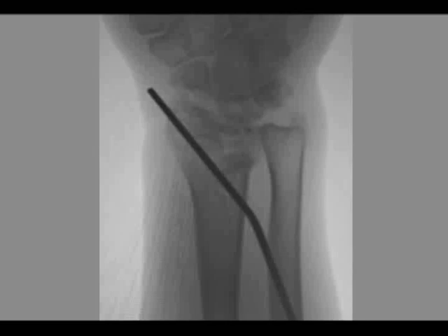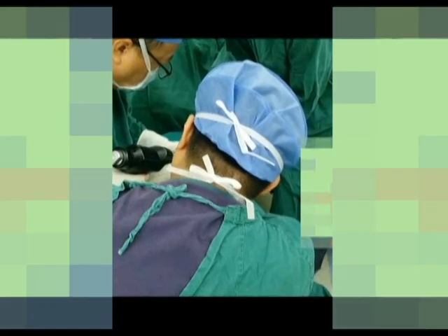The insertion point is often located at the radial side of the radial artery at the level of the proximal fragment. The radial artery can be palpated easily. Then we apply a force on the proximal fragment of the radius radially through the second K-wire to correct the radial translation. The procedure is performed under axial distraction maneuver. The quality of reduction is checked under C-arm.